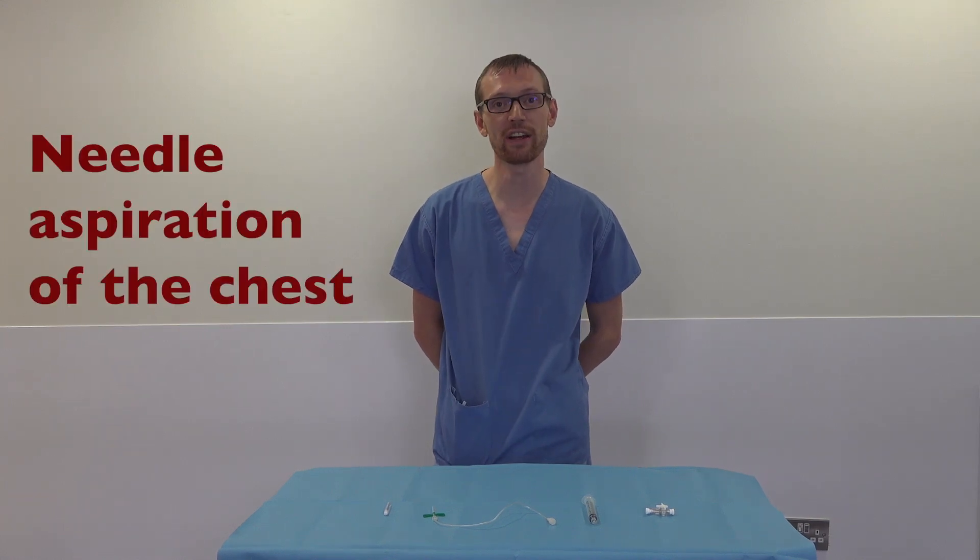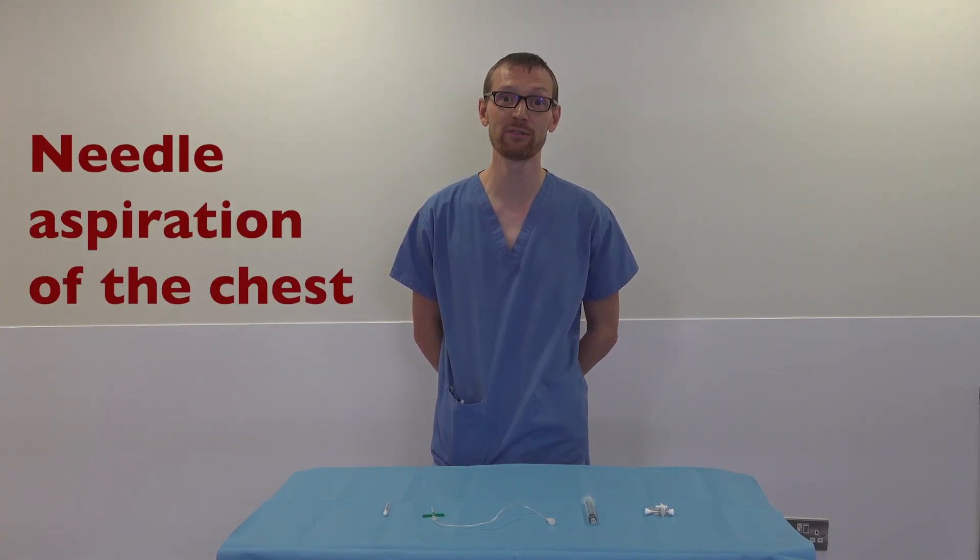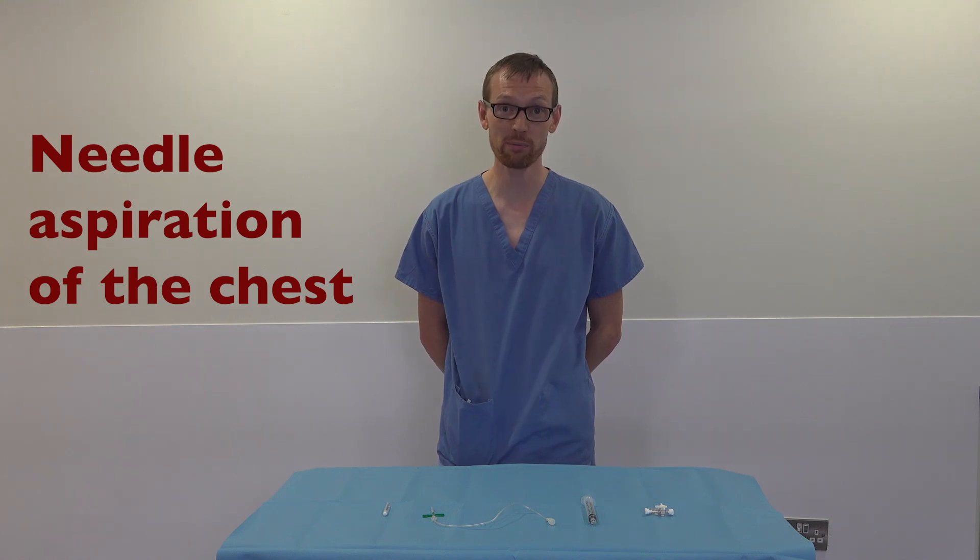Hi everyone, I'm David Cummins, I'm one of the NICU Registrars and an Education Fellow for RMH, so you probably know me quite well. Today we're talking about pneumothorax, specifically tension pneumothorax, something that we encounter quite a lot in our population.